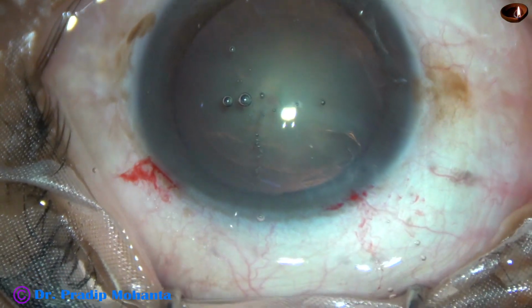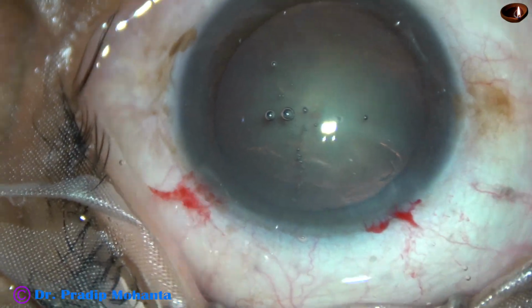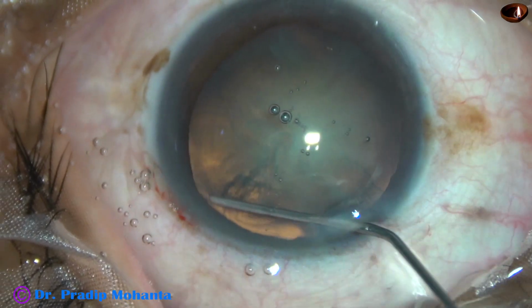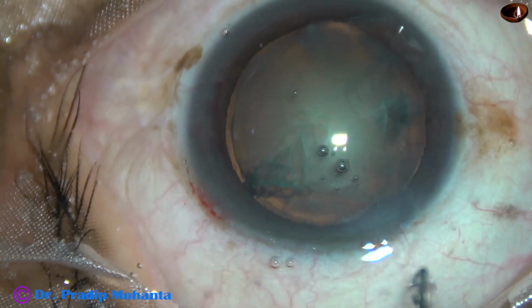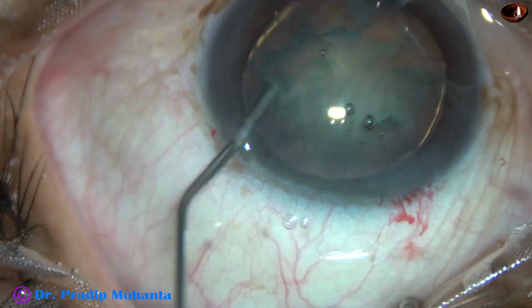Now hydrodissection. BSS is passed just under the anterior capsular rim with a 27 gauge cannula, and hydrodelineation is also attempted, and then the nucleus is rotated.